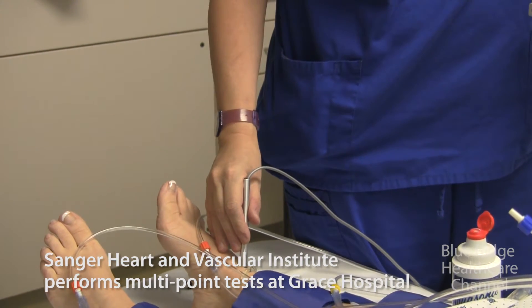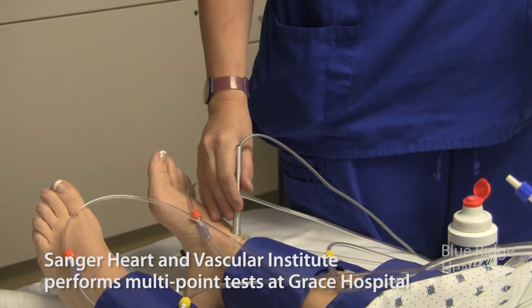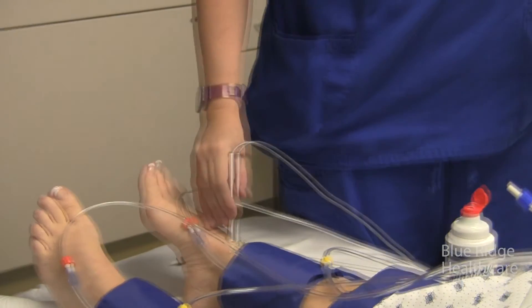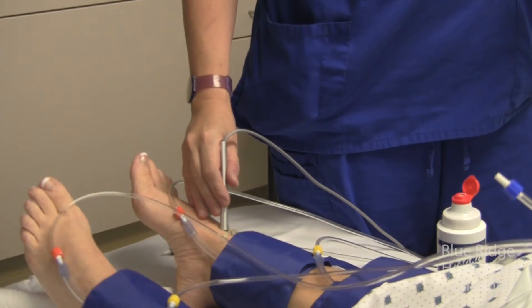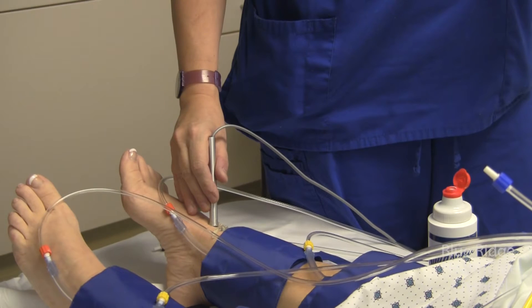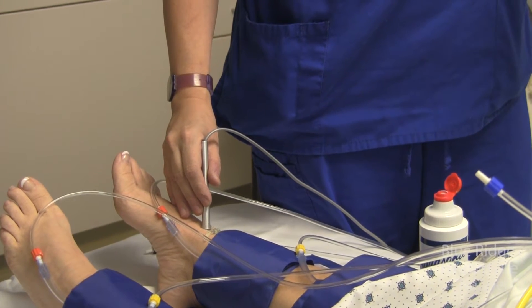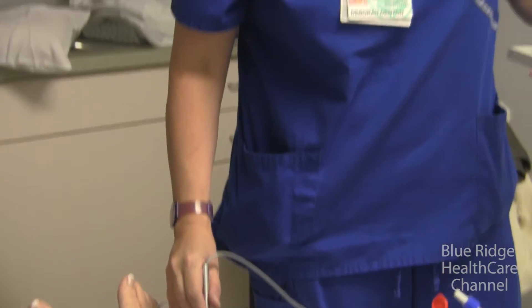So you don't have to move it around? You just put it on? You put it right on the artery and then after you've been doing it for many years, you can pretty much find the artery. When you inflate, you're actually cutting the blood supply off, and then as you let the cuff down and hear the beat come back, that's the blood pressure.